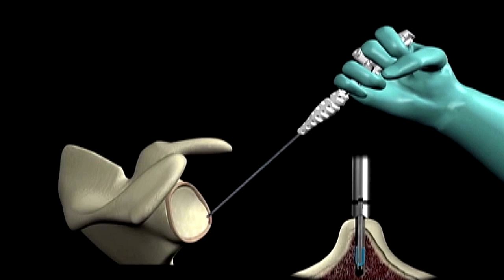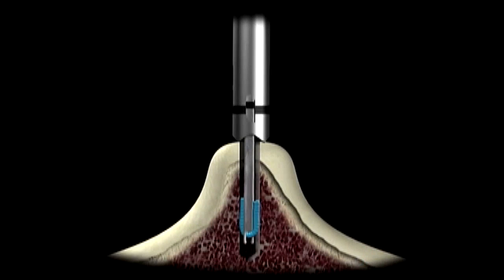Lightly mallet the handle to fully seat the anchor into bone. Align the laser etch marks to ensure the anchor is inserted to the appropriate depth.